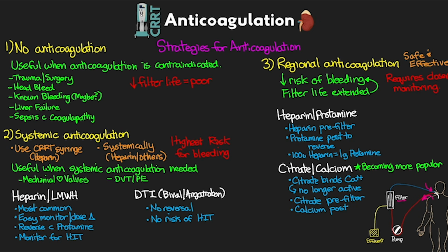Now, sodium citrate is actually going to be metabolized into sodium bicarbonate, which can actually benefit our patients who have metabolic acidosis. The great thing with sodium citrate is it has equal efficacy to heparin with much less risk. And the way that we monitor patients when using this strategy is that we're going to evaluate both a post-filter as well as a patient ionized calcium. What I'm talking about is we're going to draw blood just after it goes through the filter and then check an ionized calcium level, and we should see it be critically low at this point because hopefully that calcium has been all bound up by the citrate.